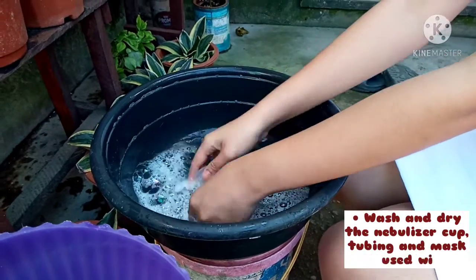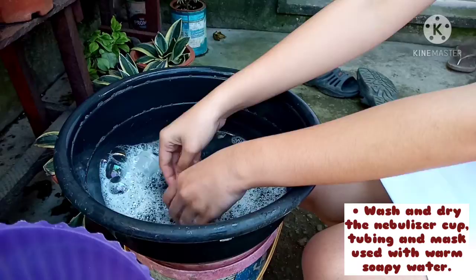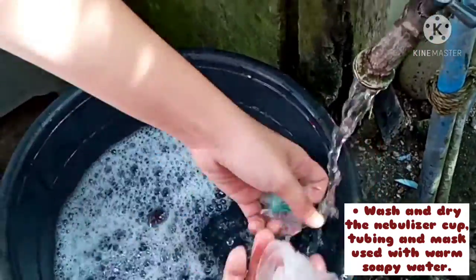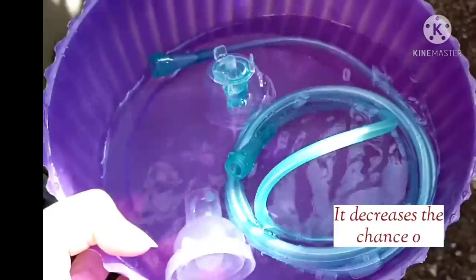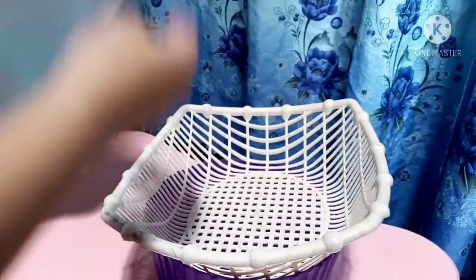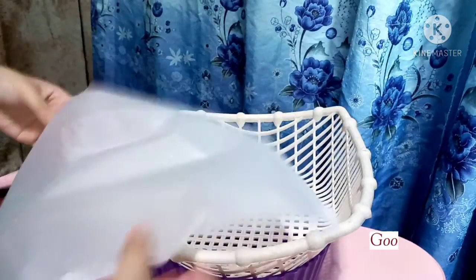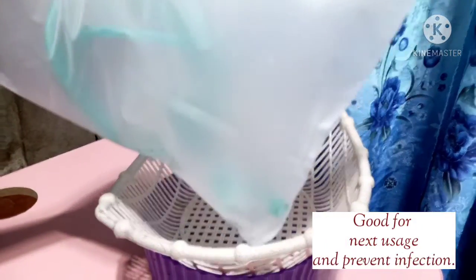Wash and dry the nebulizer cup, tubing, and mask used with warm soapy water. Soak for 20 to 30 minutes. This decreases the chance of pathogens entering the respiratory tract. Retain the equipment in a polythene bag. This is good for next usage and prevents infection.